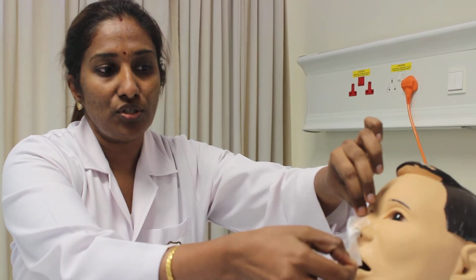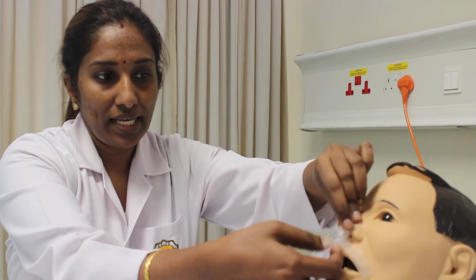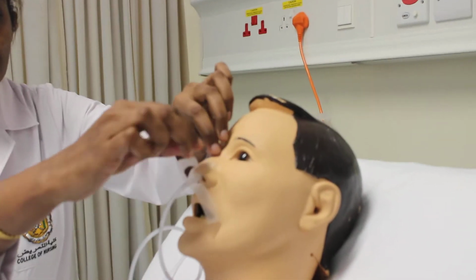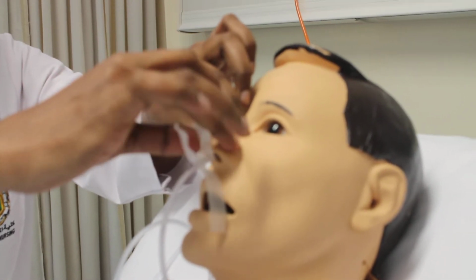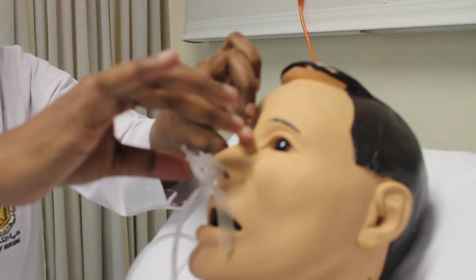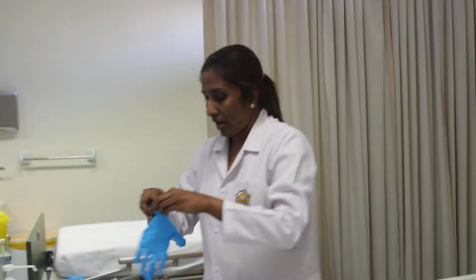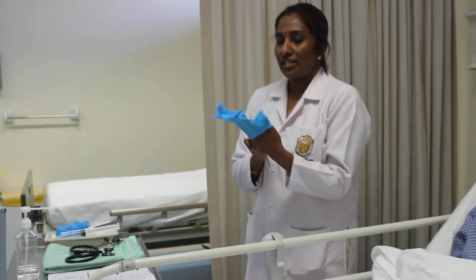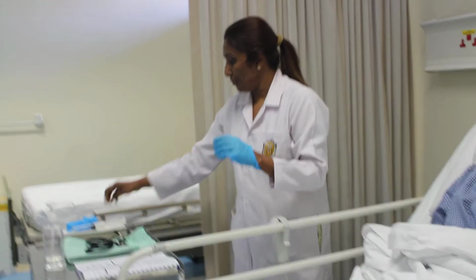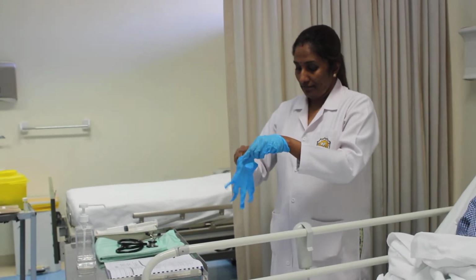This will be difficult to remove if you wear the glove, that is why you have to loosen it first. Then you will be using your gloves, because if there is any spillage of fluid from the tube, you have to make sure that you are protecting yourself.